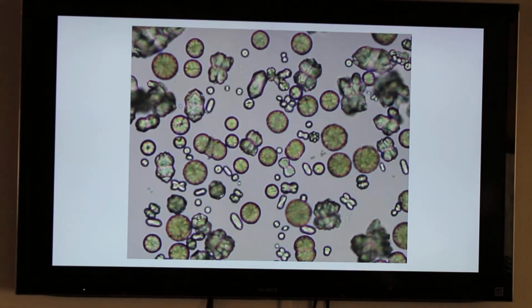So our first picture, number 1, this is identified as a calcium carbonate crystal. This is the one that you would see in horses and rabbits. And they come in 2 different shapes. Sometimes you'll see them in these little circular, and sometimes they'll come in like these dumbbell shapes. But both of those are considered calcium carbonates.